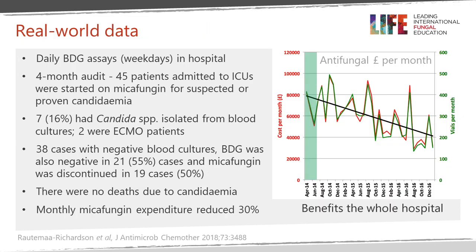And here's an example from our hospital where BDG was run every day during the week. They did a 4-month audit of these samples and the patients for whom they were sent. They're admitted to the 2 ICUs, and these are patients started on micafungin for suspected or proven candidemia. In fact, only 16% of these patients had Candida isolated from blood. 2 of those were ECMO patients who have a higher risk and rate of candidemia.